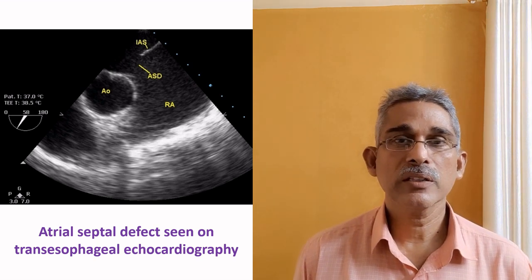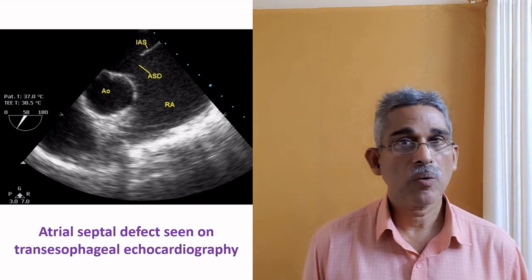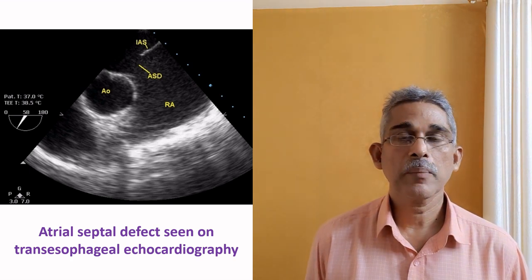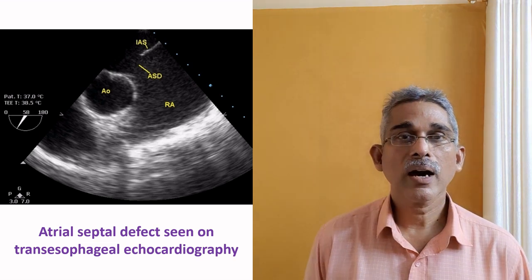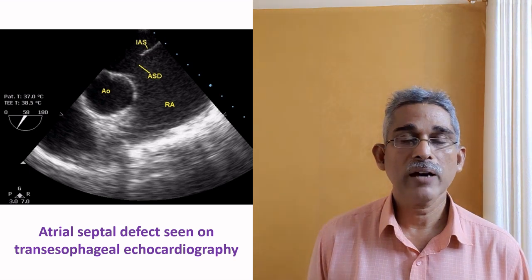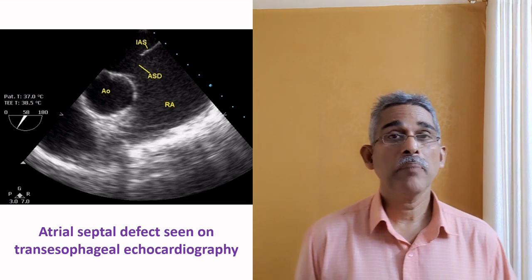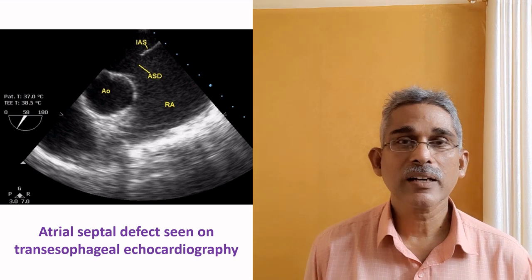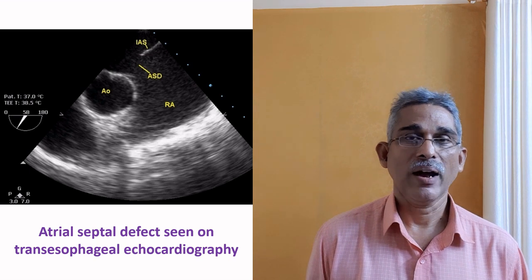In usual adult echocardiography, the probe may be about 2.25 megahertz. For pediatric, you can have 5 megahertz. For neonatal, you may have 7.5 megahertz or 10 megahertz. So, a transesophageal probe can have higher frequency for that particular individual, and you have better, higher resolution imaging. For example, for left atrial appendage clot evaluation, transesophageal echocardiography has an advantage.